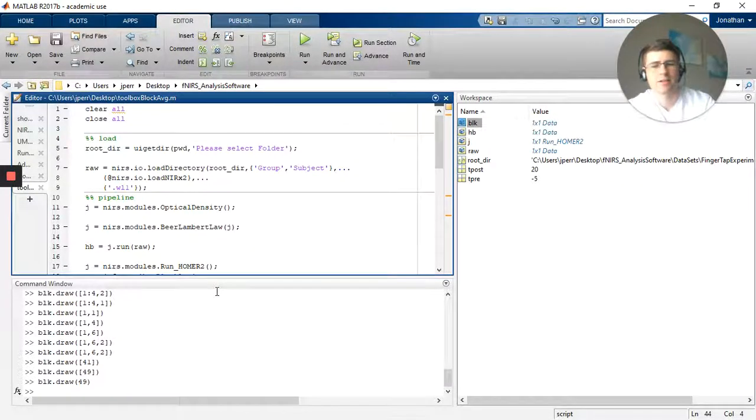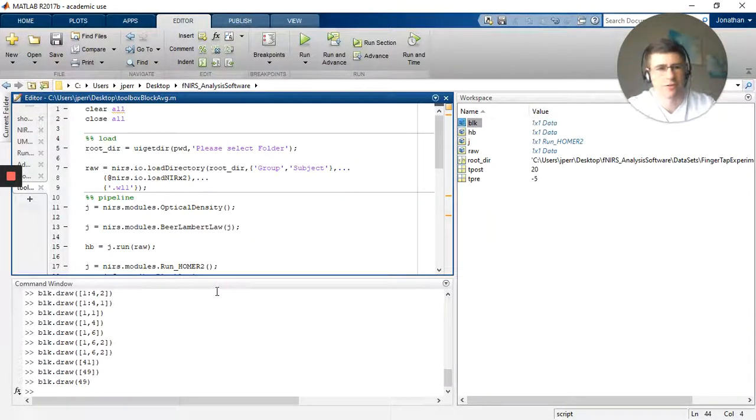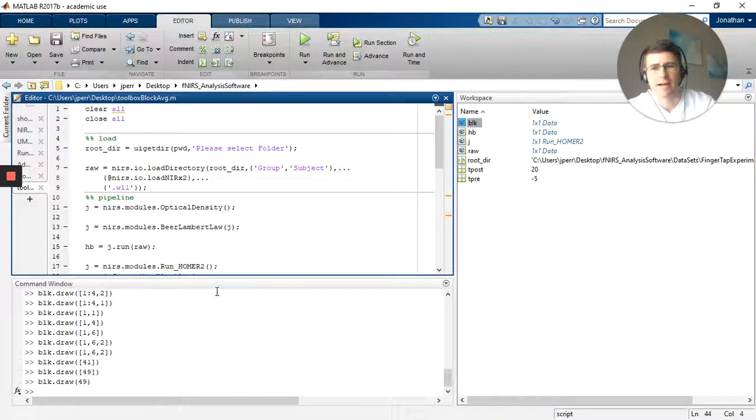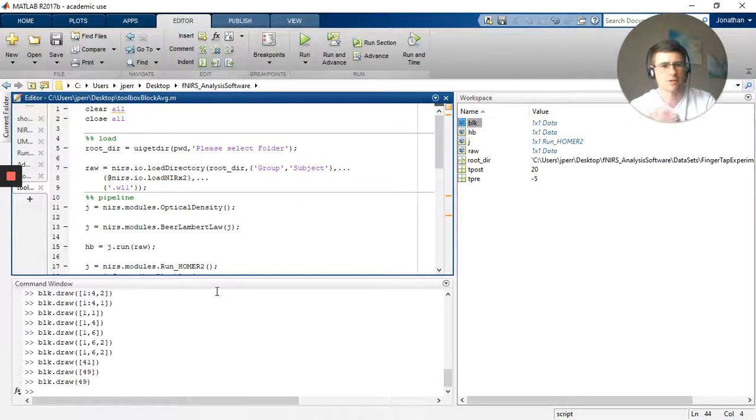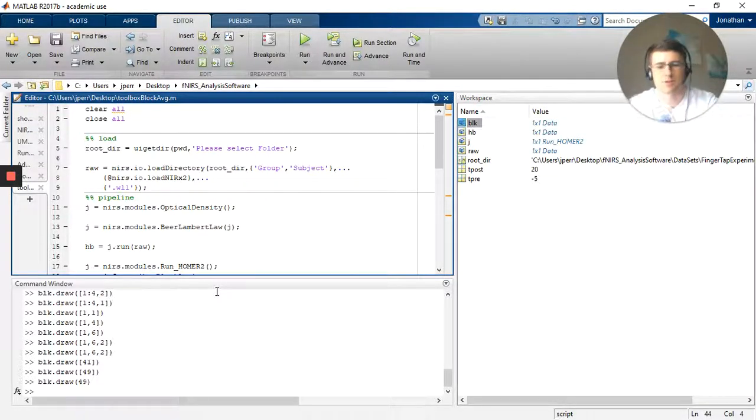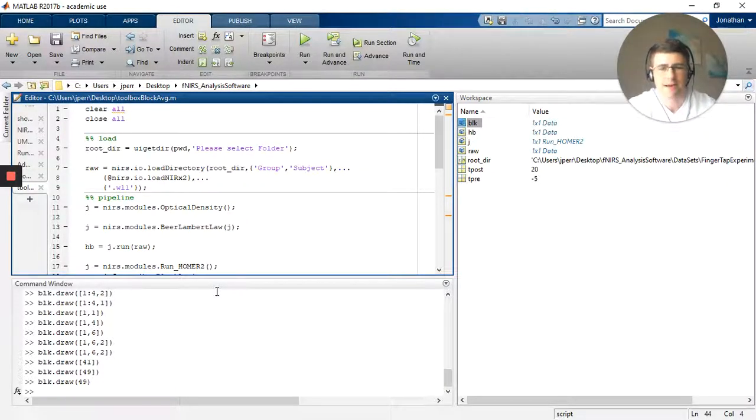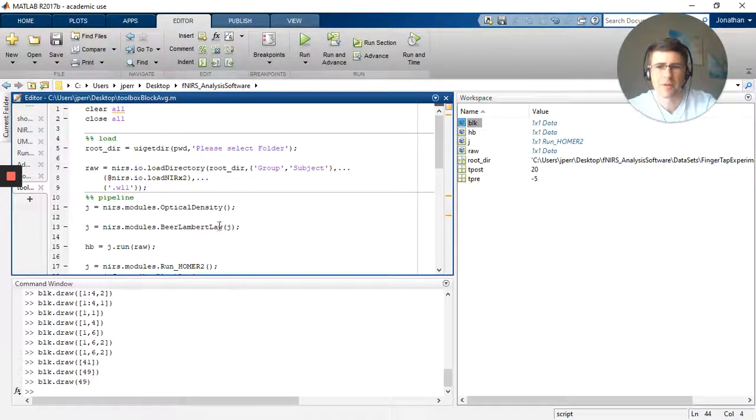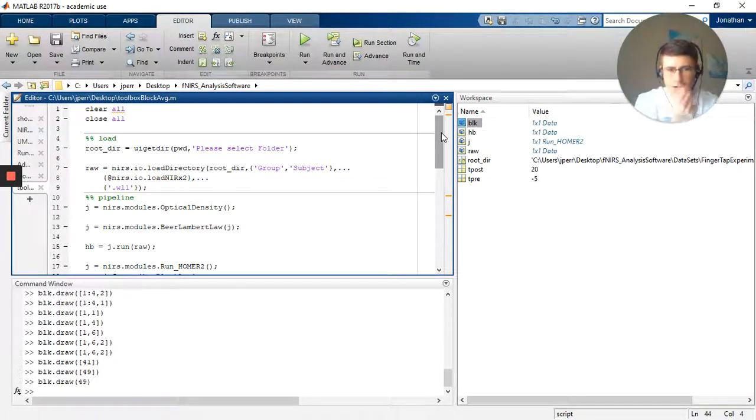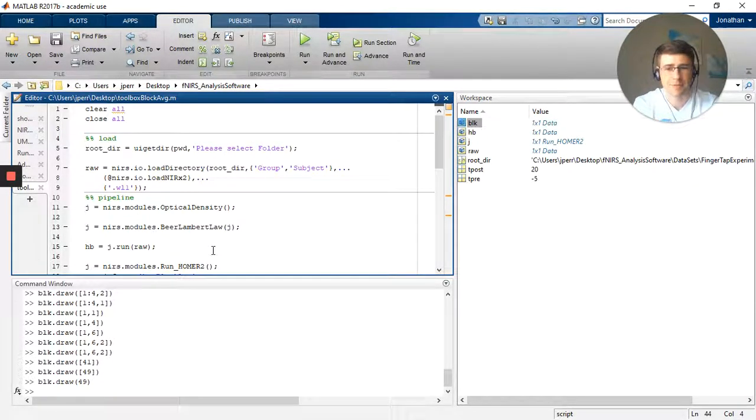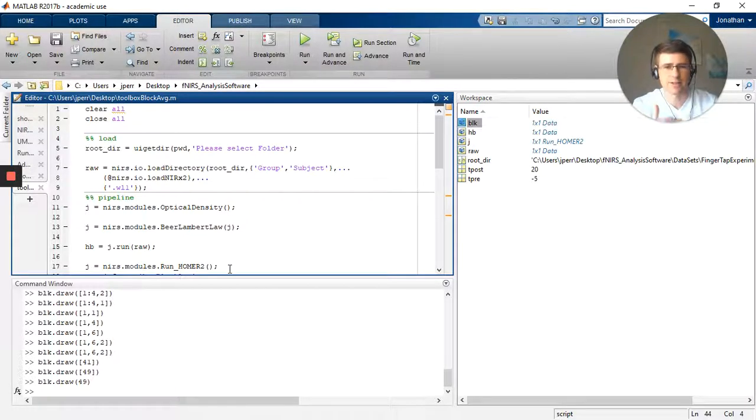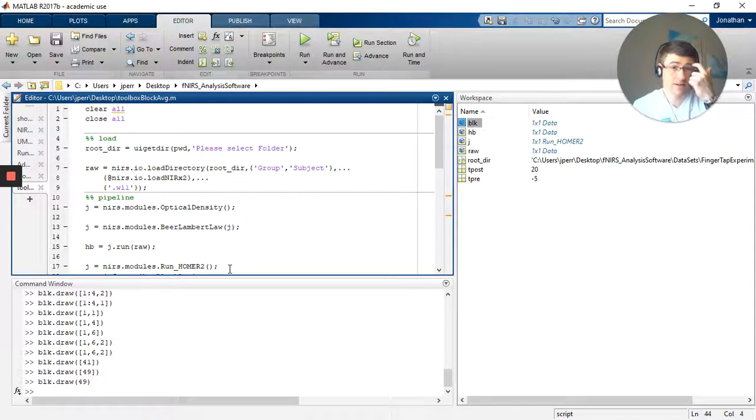Alright everybody, this video is going to be a quick overview of how to do a block average in the NIRS toolbox. It's not quite as straightforward as you would think. You're actually going to be calling a Homer2 function in the NIRS toolbox, but the toolbox has done a very good job of enabling this. And not just Homer2, there's actually several other toolboxes as well that are available within it. So I'm going to walk you line by line in this script, and it's going to be a very rough or basic pipeline to get a block average out.